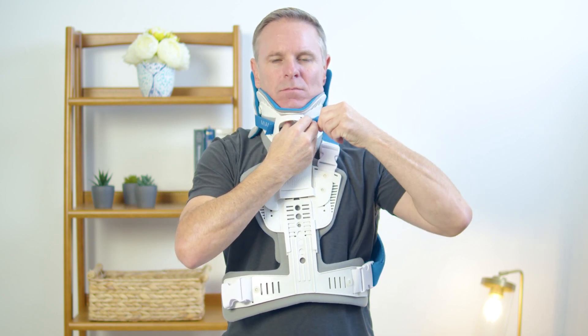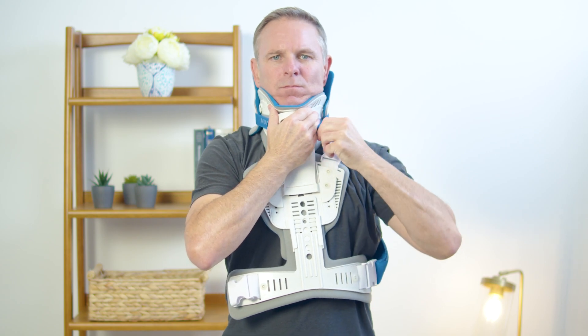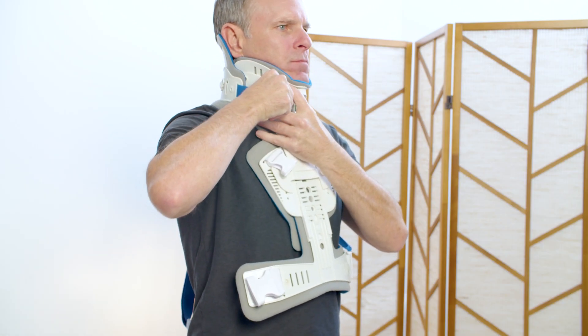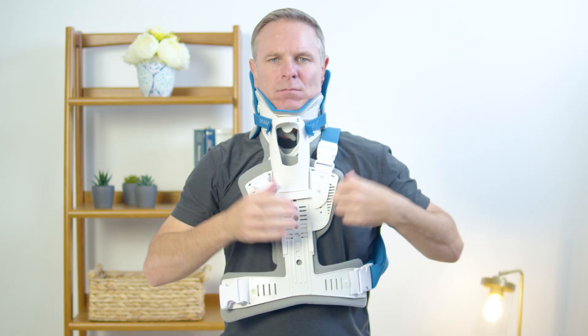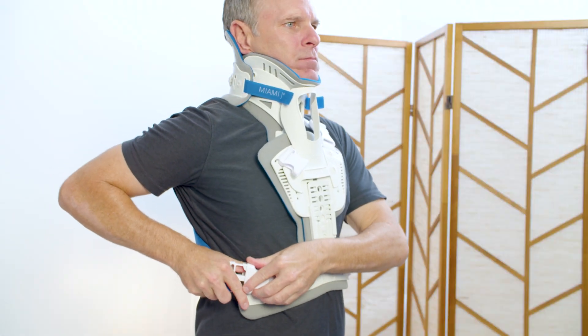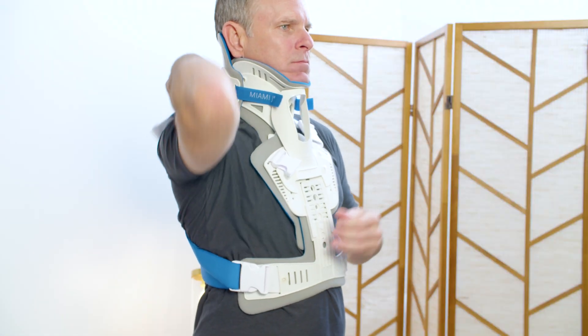Ensure straps are centered on the front adhesive sections. Note: using a mirror for reapplication may be helpful to ensure a proper fit has been achieved. Next, fasten the waist buckle and lastly the shoulder buckle.